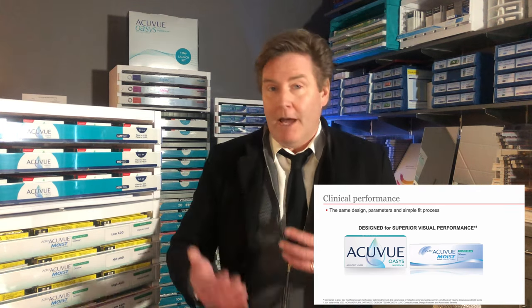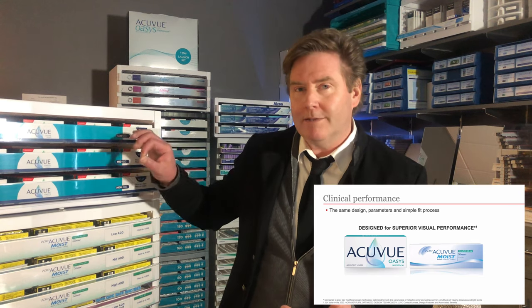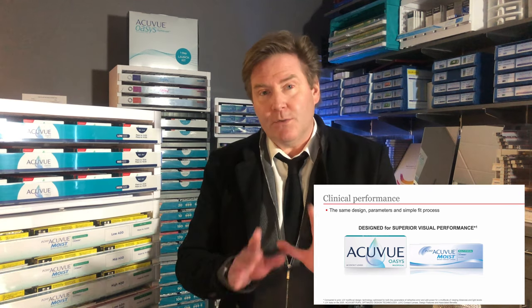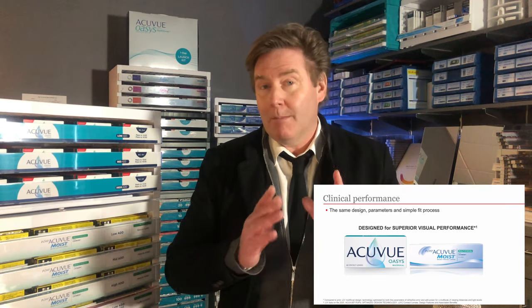So if you've been wearing the Moist multifocal lens and you like the vision of that lens, you're going to also like the vision of the two-week AccuVue Oasis multifocal. This also gives you confidence that this lens has been tried, tested, and worked really well for lots of patients.